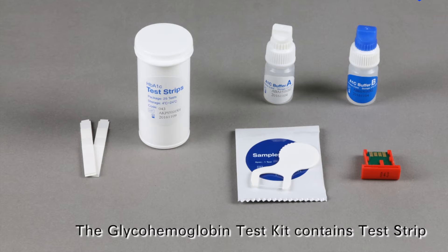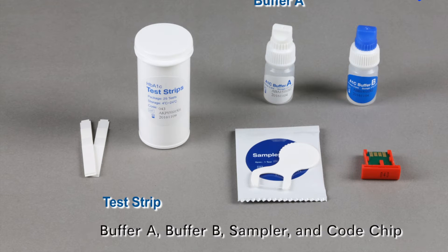The GlycoHemoglobin Test Kit contains a test strip, buffer A, buffer B, sampler, and code chip.